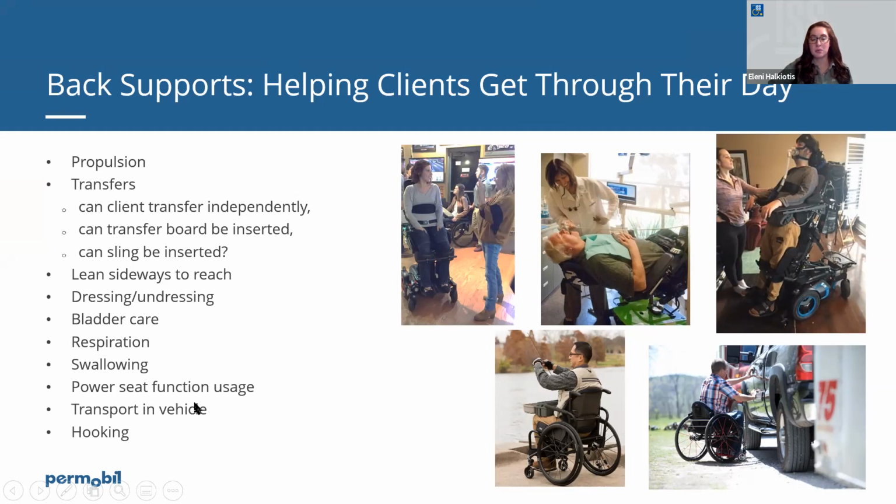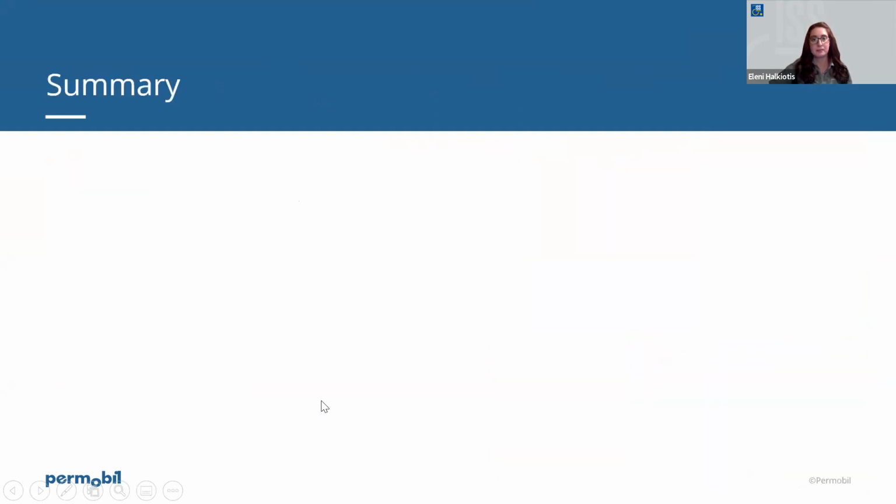And hooking. Sometimes clients functionally need to hook their arm around the push handle, and considering what kind of strategies they use with this hooking technique to perform MRADLs. So we make sure the back support works with them and not against them.